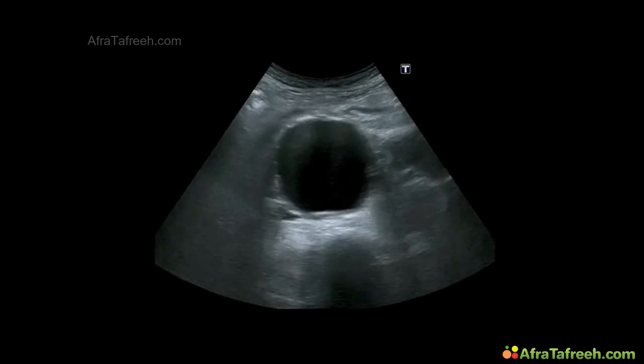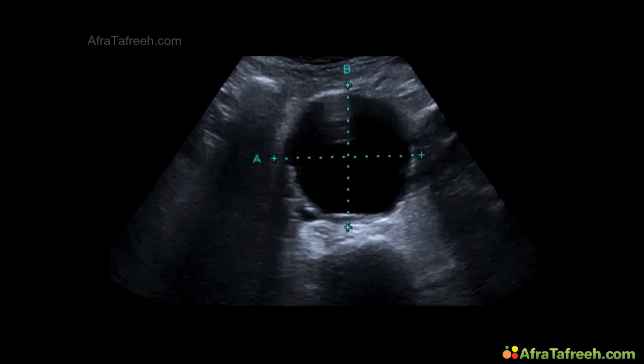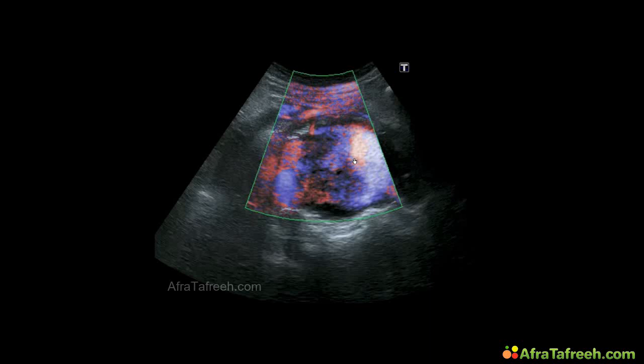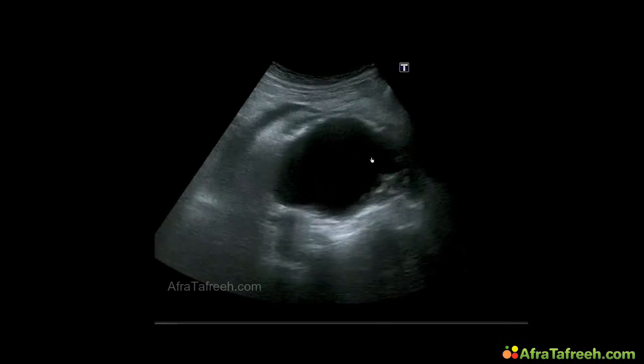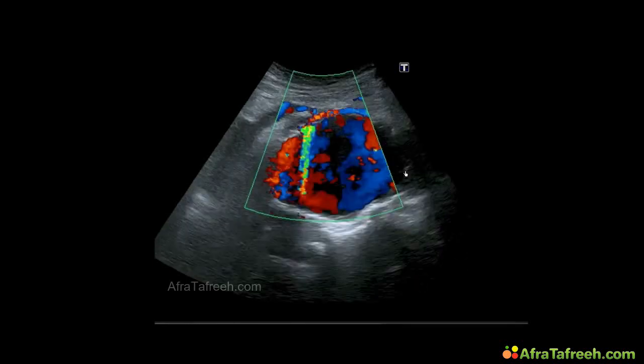and my eyes became wider and wider, and so did the diameter of the abdominal aorta of the patient. So I hurried to call my colleagues and to stop the planning of the gallbladder operation. There was a 7-centimeter abdominal aortic aneurysm present, and maybe the pains were caused by this vascular problem. And in the next scan, we also see color Doppler. This huge, tremendous aneurysm is filled with blood.